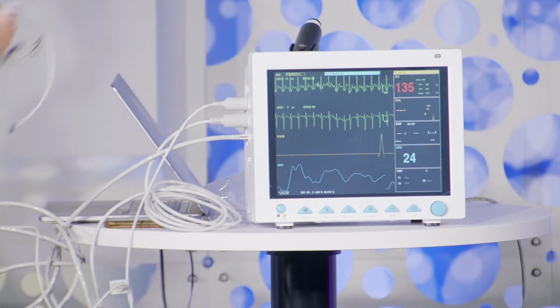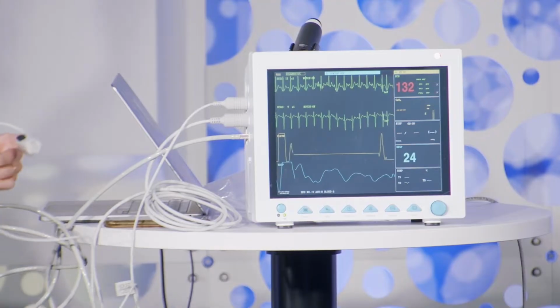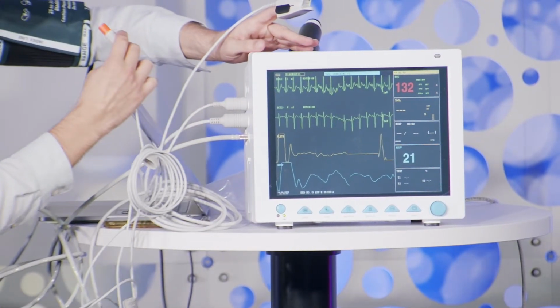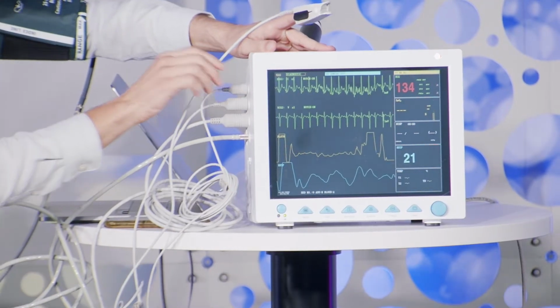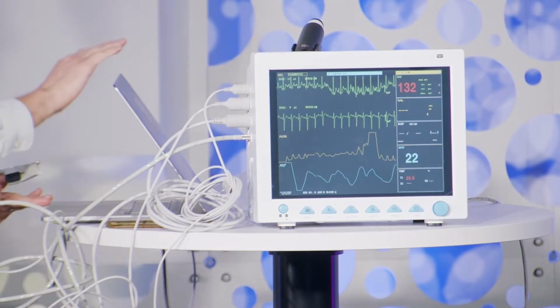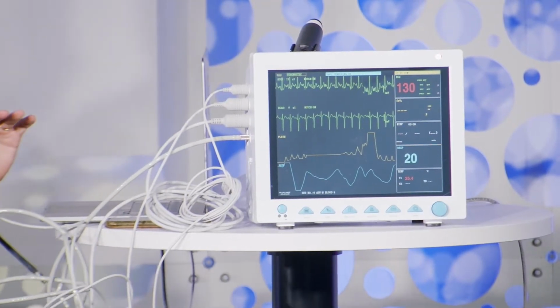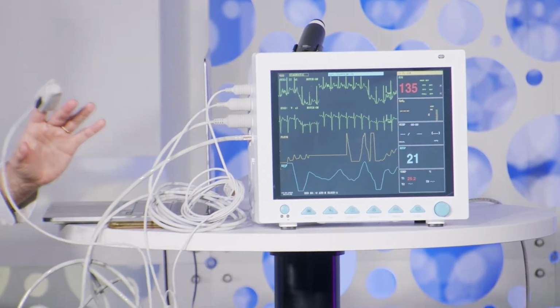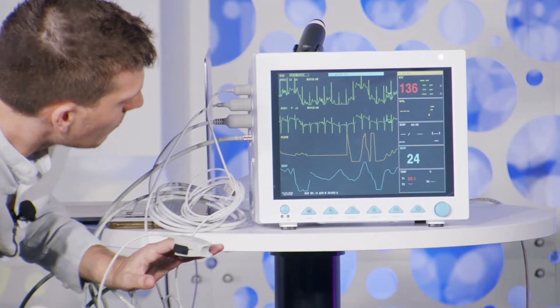What we wanted to do is intervene in the middle, and find a way that when a sensor is reading some value, we can customize it and put our own value. The example here is 0, but it could easily have been any other number. Again, I'm not a doctor. I don't know what I need to put here to make somebody scared and shove a needle into a patient. But I'm sure we can find out with a doctor, since they have their own procedures.